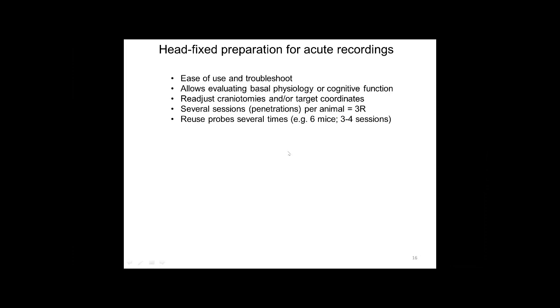The head-fixed preparation has many advantages. It is easy to use and very easy to troubleshoot if you have any problem. It's simpler to learn, particularly if you don't have experience in chronic recordings. It allows you to evaluate basal physiology because you can have your animal doing nothing really. They get a bit habituated to being on the wheel, and they can run, they can stop, they spend the time over there. Or you can couple that with cognitive tasks, I will show you later. With this probe, you can readjust craniotomies, and therefore you can improve your targeting coordinates.